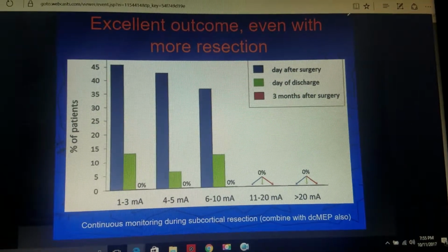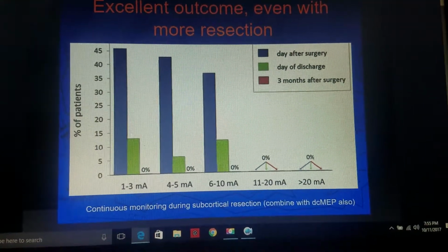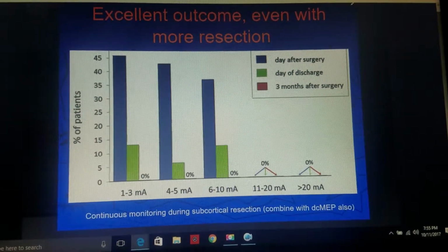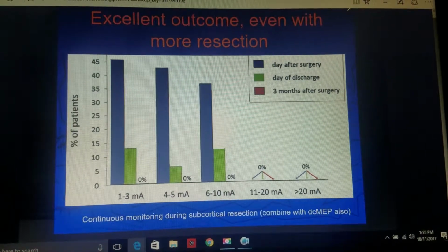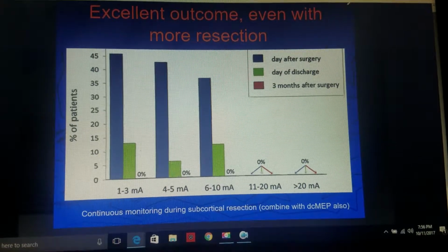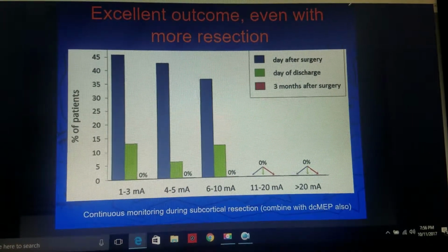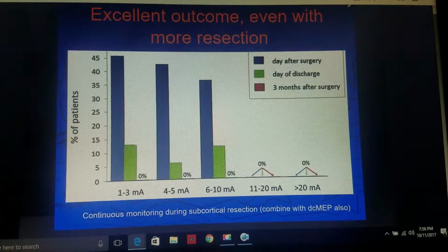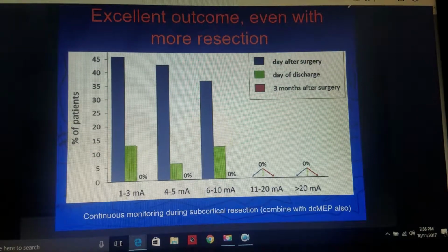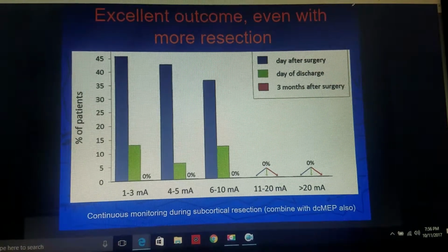And I've got to tell you, surgeons love this. They particularly love the electrified Frazier suction. It gives them great confidence. They're sitting there just sucking away, dry, and all of a sudden say, "Whoops, I got a response." And the fact that they get responses and then you can find the exact threshold, and other times you don't get a response, even if you were to go up to a much higher level, gives them the confidence that they can now move fast here, but they'll be alerted immediately when it's not safe to go fast and they have to go slow. That's the key to getting same-day surgery accomplished, so that you can end the surgery the same day you started it.